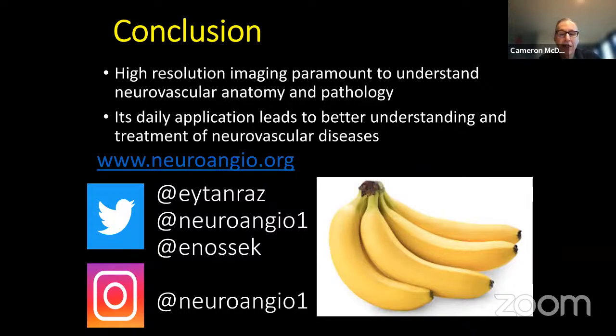I would like to talk just a little bit about the accessibility of this kind of qualitative imaging and really integrating it into the practical work of the busy vascular lab, and how do we, I guess, democratize this ability to see that kind of detail.